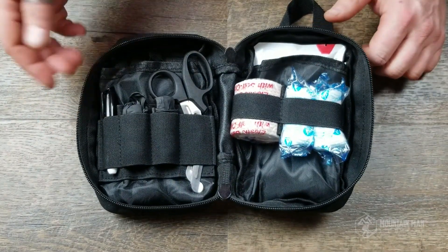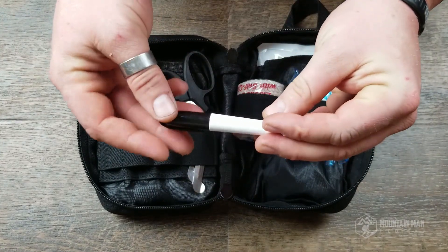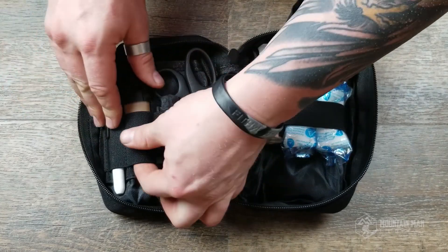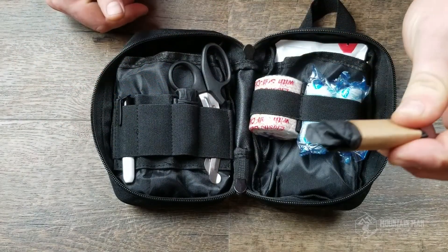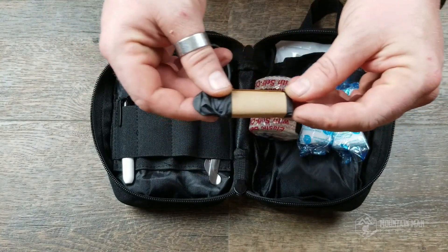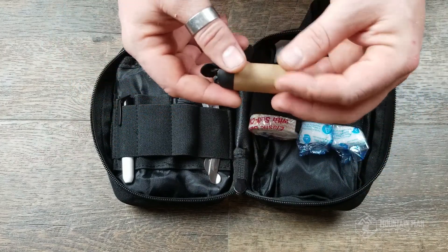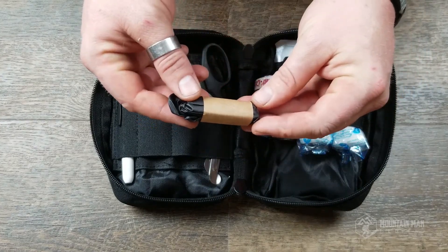Starting on the left side of the pack: we've got a permanent black marker for writing vital signs, writing the time on the tourniquet, taking notes, taking an address — whatever you need. We've also got some heavy-duty nitrile gloves. These keep the patient safe and the provider safe. I included two pairs because in my experience you often rip the first pair trying to get them on quickly, or you might rip both pairs in a hurry.